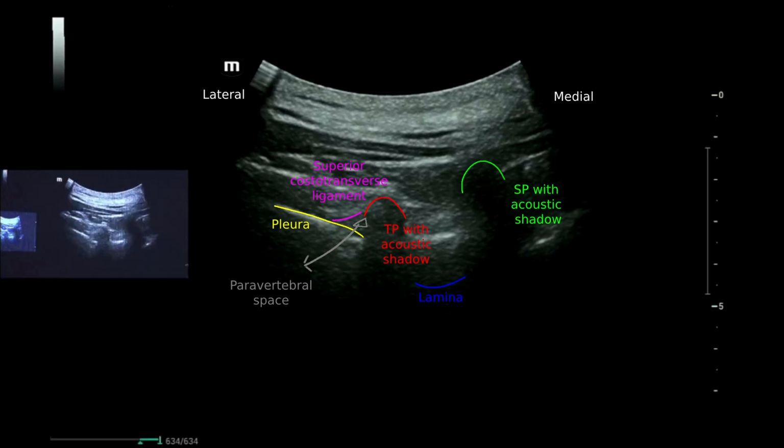But actually, the paravertebral space is in the dark side of the moon here. It's under the bone. So that's why he also kept saying, where is the tip of the needle? Because the tip could be in the shadow. So you may be injecting it into the vessel, into something underneath it. So when you do paravertebral injection, you must always inject saline before the drug. Saline is a surrogate for documenting that you're in the right space, and you will see pleural displacement and then incremental injection. So saline always first. Okay, so now you can see actually the paravertebral space is here, okay? And this is the transverse process.